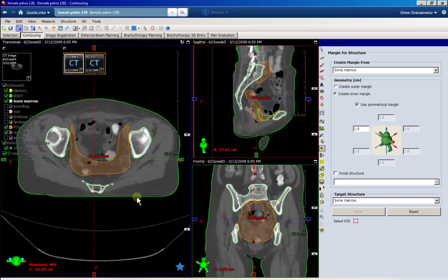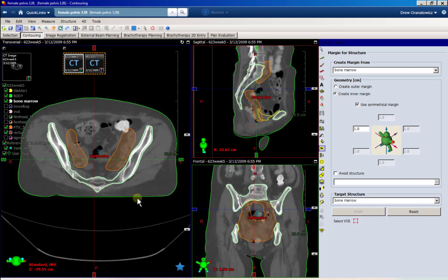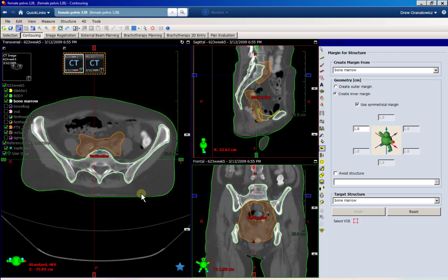This is a really quick tutorial on how to contour bone marrow. You can do ribs like this, or anything you're trying to contour in bulk — you can follow the same general process.